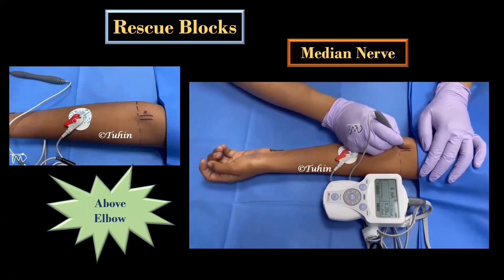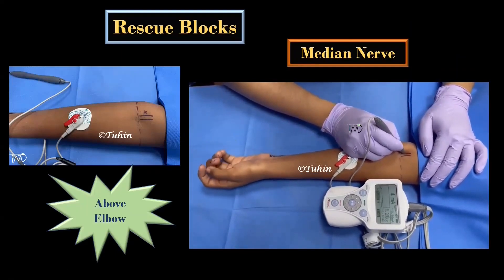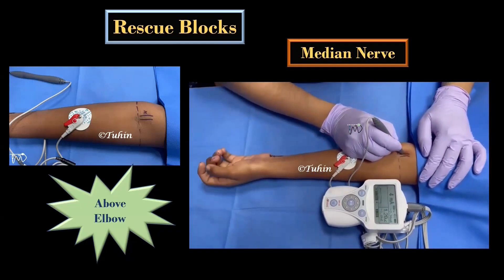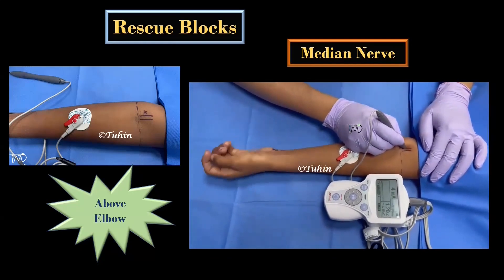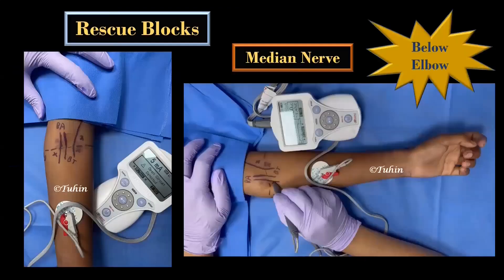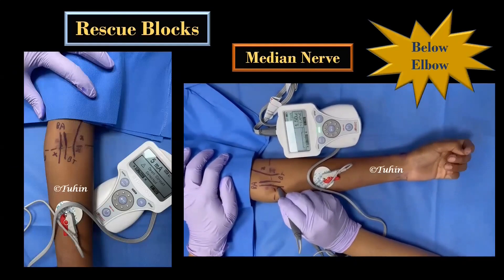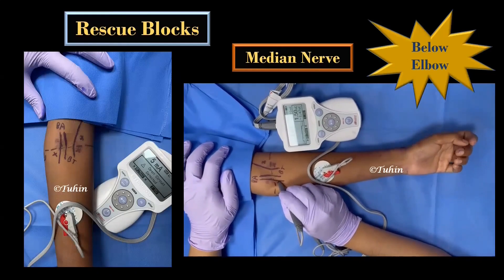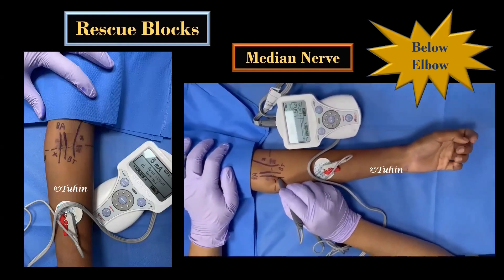Just like any other PNS guided block, knowledge of relevant anatomy and surface landmarks forms an essential component. For an above-elbow median nerve block, the needle insertion point is about 1 cm above the elbow crease and just medial to the brachial artery. Below the elbow, it is almost similar — just 1 cm below the crease and medial to the brachial artery. Here you will get motor responses in the form of finger flexion, wrist flexion, or thumb opposition.